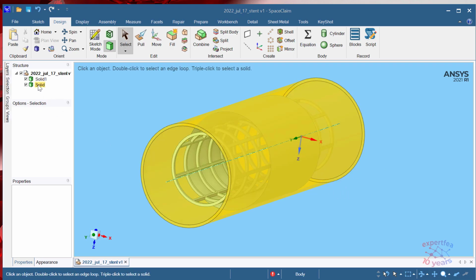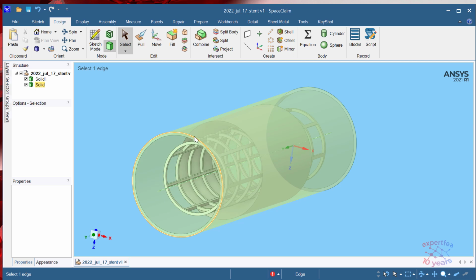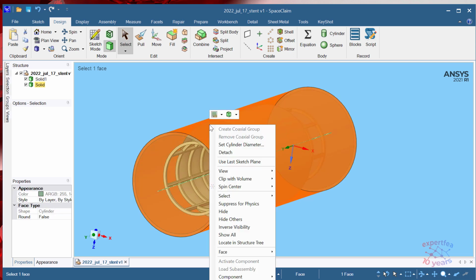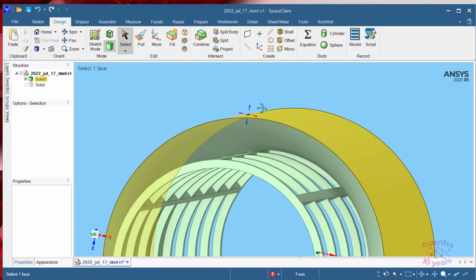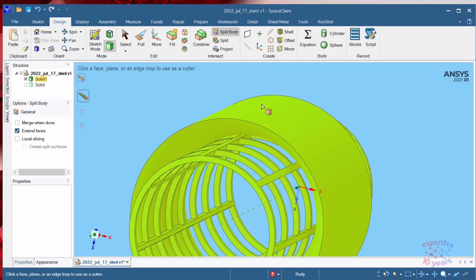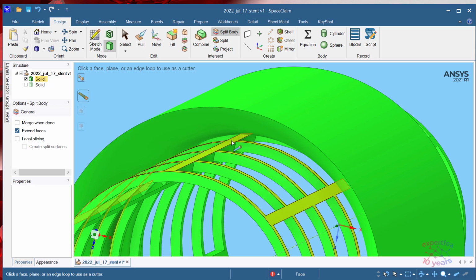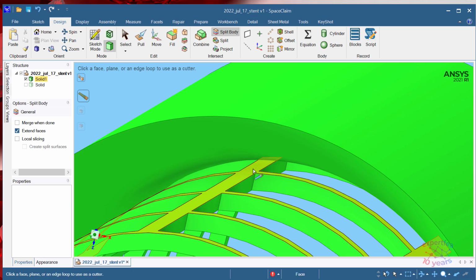So what we can see is that the stent somehow united with the plaque, so we need to separate them. Let's right click the vessel, hide. Then we have this option, split body. Click a target object, of course this body. Then we have the cylindrical face, which is somehow interrupted by the plaque here. Let's see if we can separate.